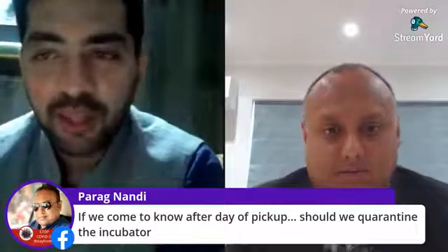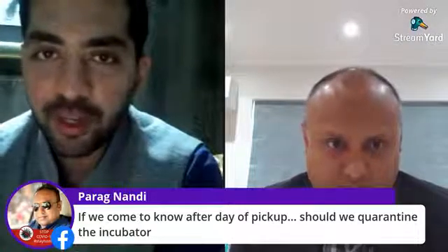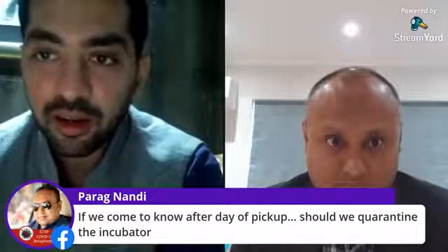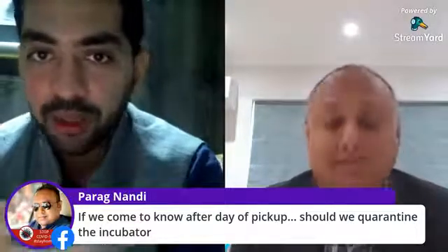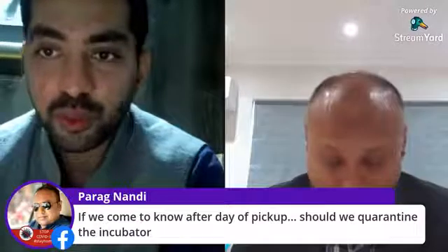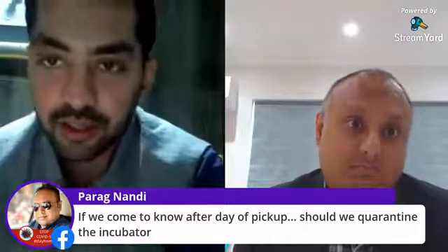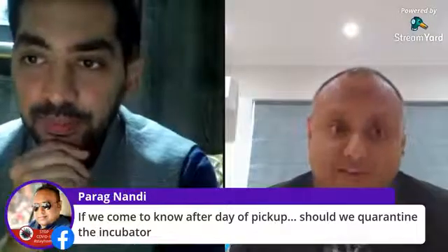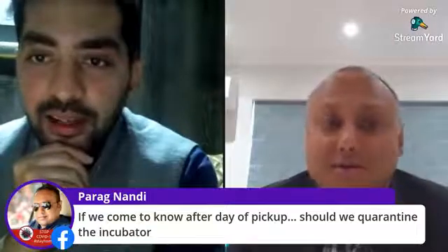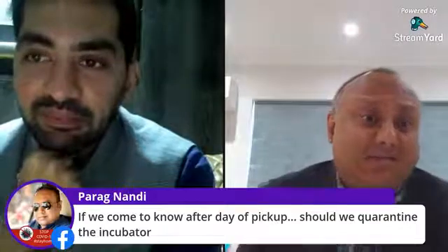I don't have a closed system in my laboratory, but from what I know, it does provide humidified air inside the chamber, right? And this could be a potential source which might contaminate all of your equipment inside, and the dishes and whatever you're doing inside as well, right? Correct. Because you use the humidification system, and you could have the virus staying in there overnight, and next day it's still there.